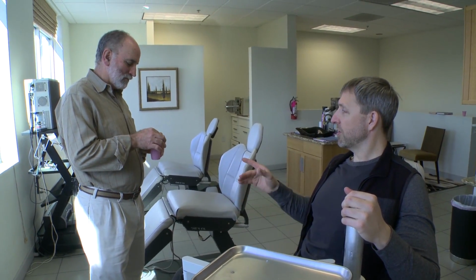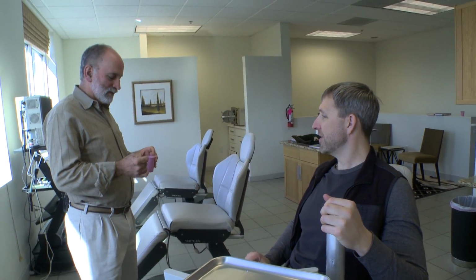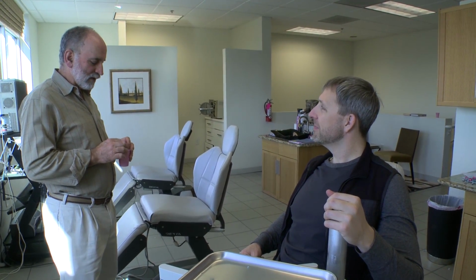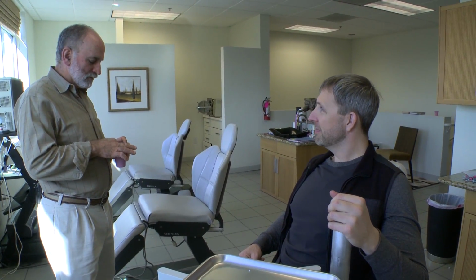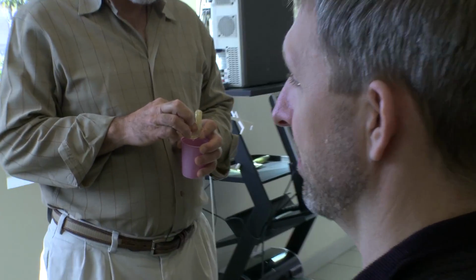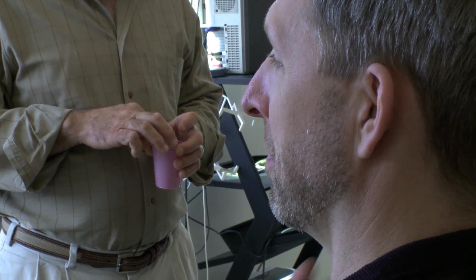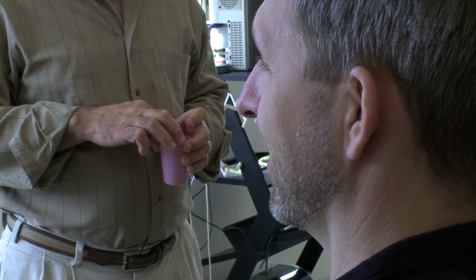All right, so now we have some squishy solvent-based stuff on here, so I'm going to hold my breath while we do this. Is it time for me to mold it? Almost, not quite. Yeah, the smell of that stuff even kind of gives me a bit of a buzz. I don't know what's in it, but. Methyl methacrylate. I can smell it from here. It's interesting. I probably should have. Actually, I do. I have a tube of my glutathione back there. I'll take that after I do this. Help my liver take care of whatever that is.